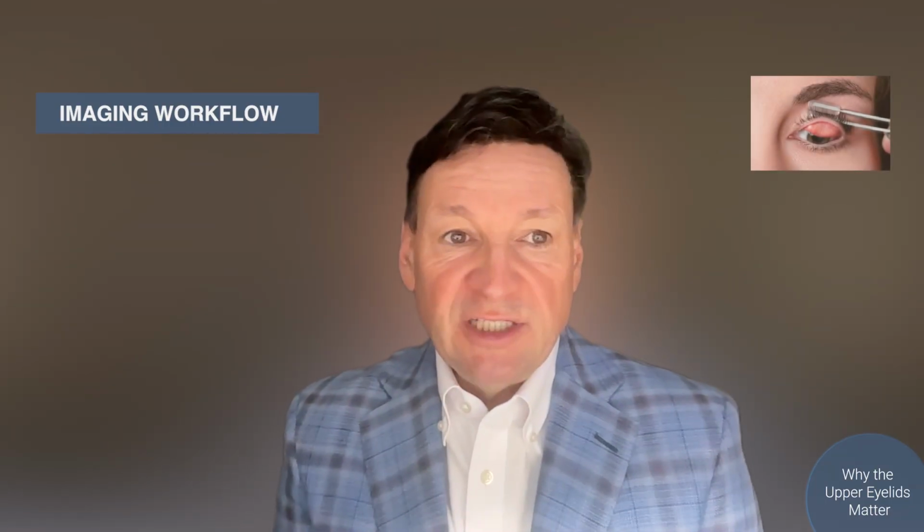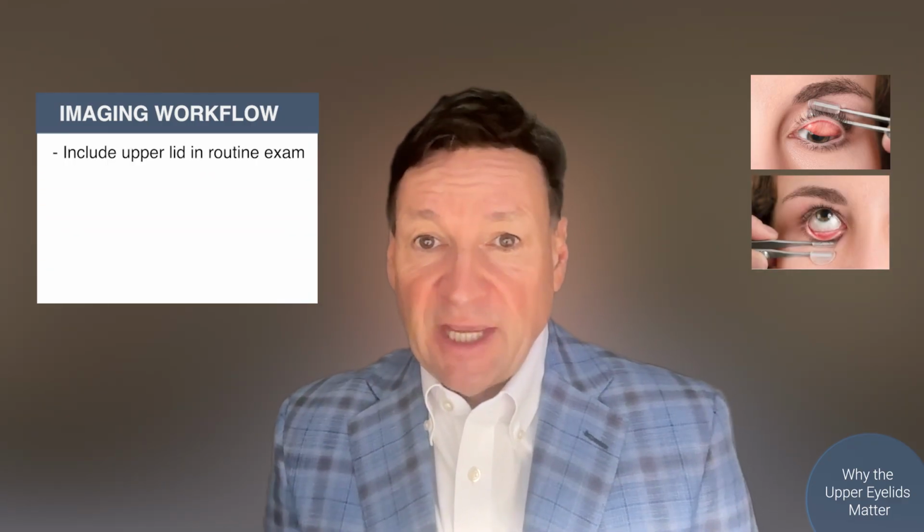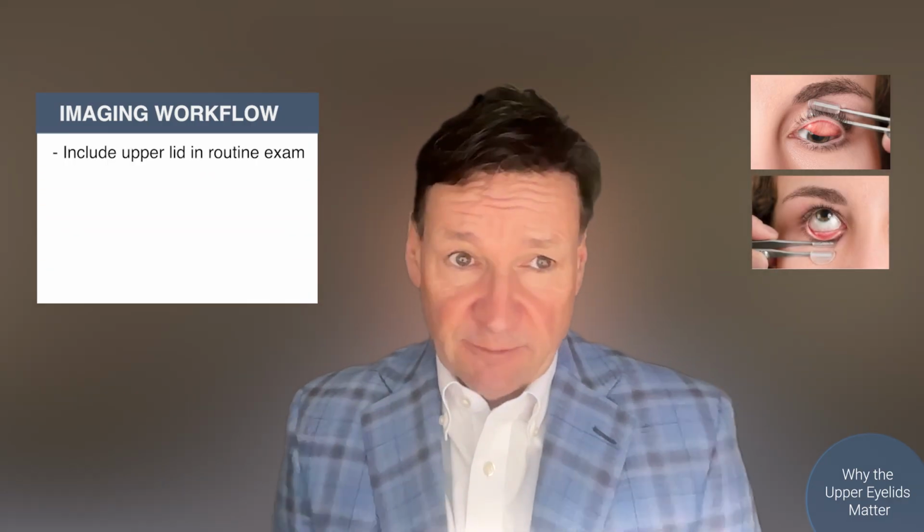At this point, some of you may be thinking, this all sounds compelling, but I'm already running behind in clinic. How do I fit this in? Here's the workflow that has made upper lid imaging sustainable in my practice. For any patient with dry eye symptoms, contact lens wear, or preoperative evaluation, we routinely evert and examine the upper lid as part of the slit lamp exam. It adds only a few seconds.